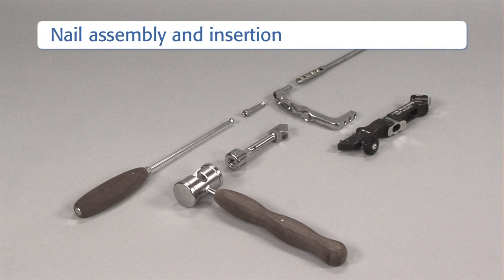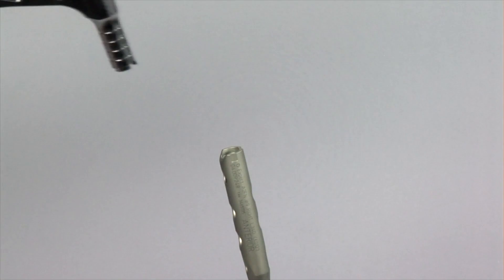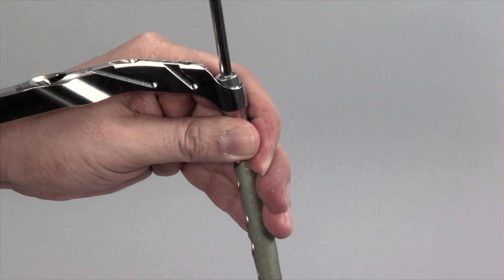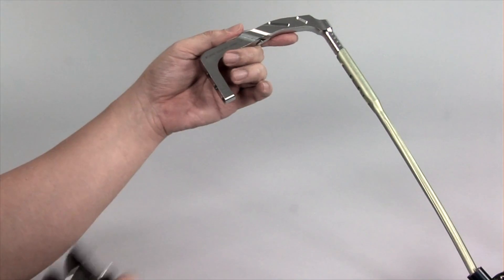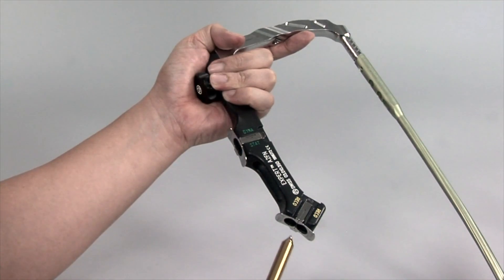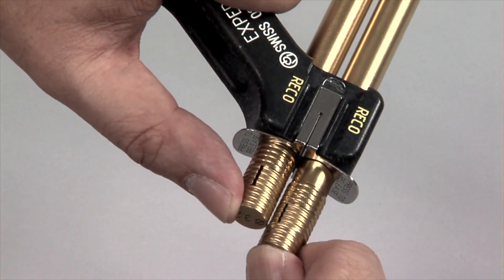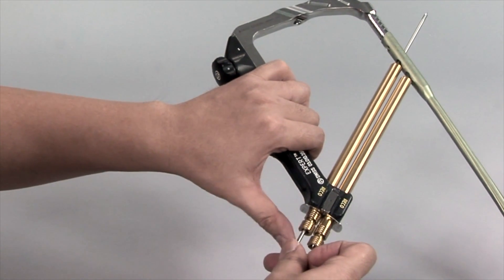The instruments needed to insert the nail and prepare for recon locking are: the hexagonal screwdriver with spherical head, the cannulated connection screw, the insertion handle, the appropriate A2FN, the connector for the insertion handle, the combined hammer, and the aiming arm. The insertion handle is connected to the nail with the connecting screw using the hexagonal screwdriver with spherical head. It is important that the tongue of the insertion handle matches the notch of the nail. The aiming arm is connected to the insertion handle before the nail is inserted to check that the aiming arm will guide the hip screws correctly through the nail. The three-part trocar combinations are introduced through the recon holes in the insertion handle. The trocars are removed and two guide wires are inserted. If the guide wires pass correctly through the recon locking holes in the nail, the nail can be inserted.